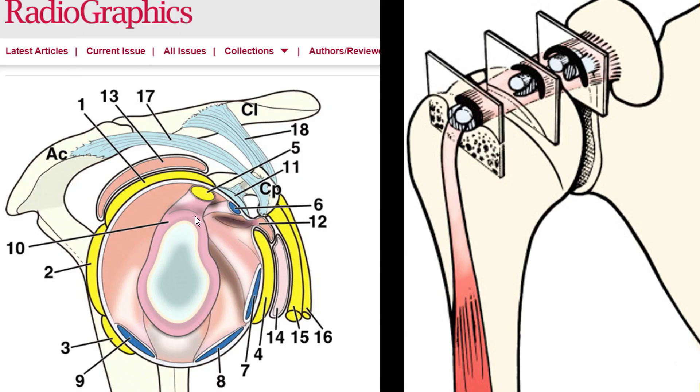Even here in this Radiographics article they show all these nice figures and illustrations with all these numbers — number six being the superior glenohumeral ligament. The only good thing about that image is that you can see it's basically a fold of the joint capsule, and we will come back to that later. Here again is this concept that somehow these ligaments look different at different sections, twisting around and then forming this sling preventing the long head of the biceps tendon from moving medially.